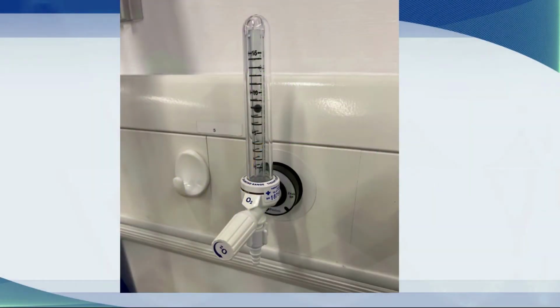Now, this is a flow meter, and you've all seen these. And when you turn the flow meter on, oxygen comes out. And what's coming out of the flow meter is 100% or pure oxygen. When we're treating most patients with oxygen, we connect some tubing to the flow meter like this, and that tubing connects to an apparatus that is applied to the face, covering the nose or the mouth or the nose alone.